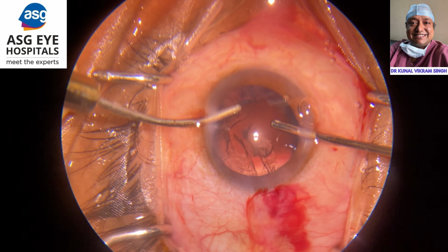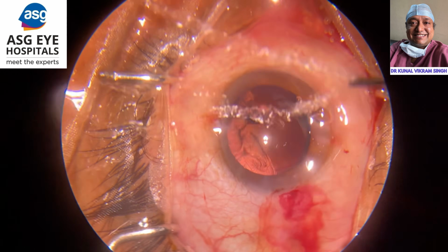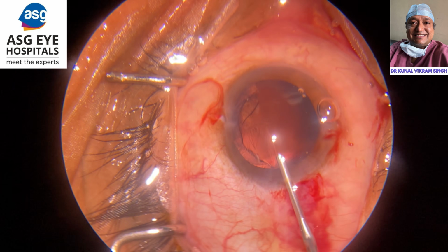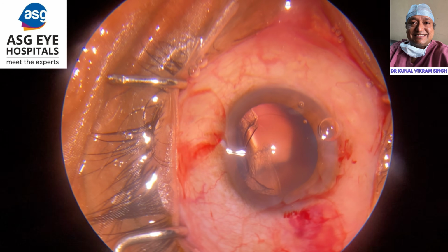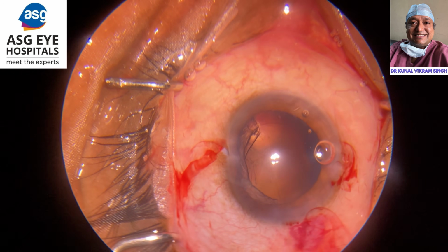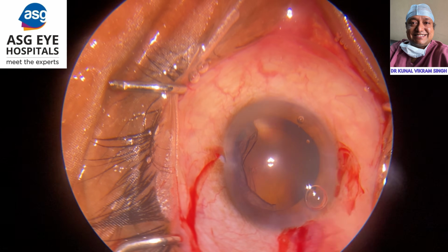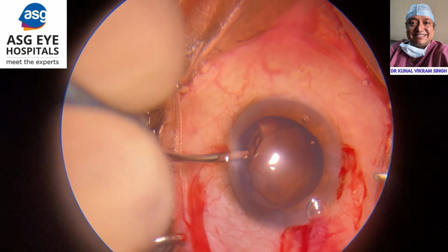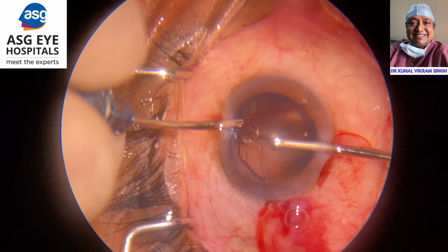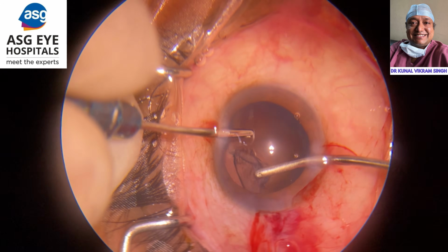So I continued with the case, and because it was a bit shallow and a single-eyed case, when I changed my hand from right to left, I filled the AC again with visco. This time, I felt that the AC was shallower than my comfort level would otherwise allow, but I went ahead. As I already said, it's not always possible to recognize aqueous misdirection early on, so I continued.